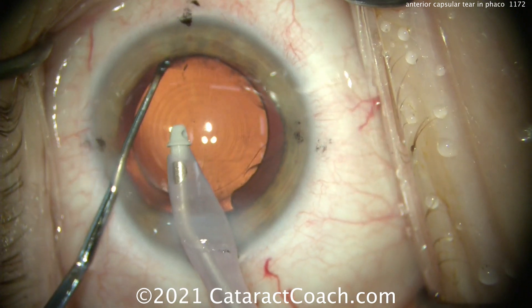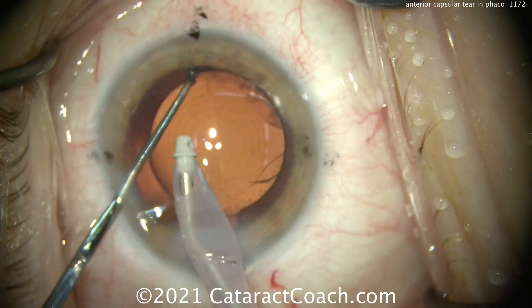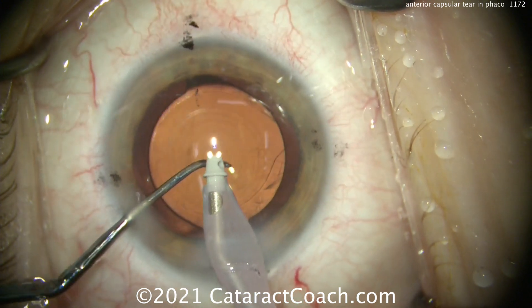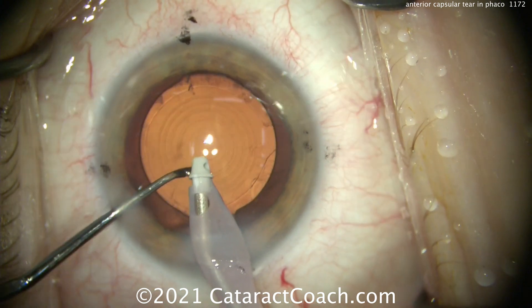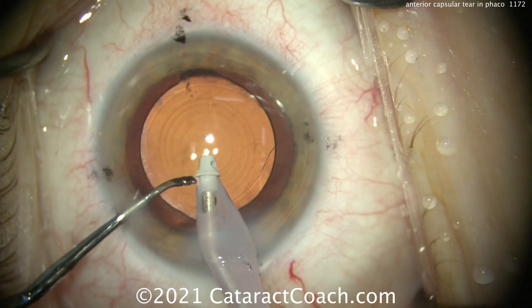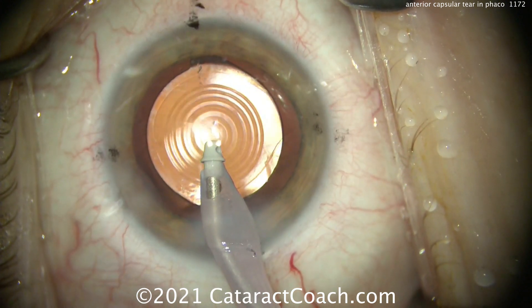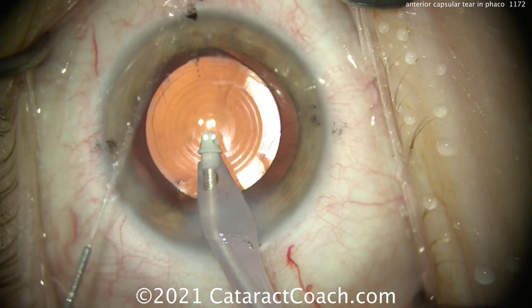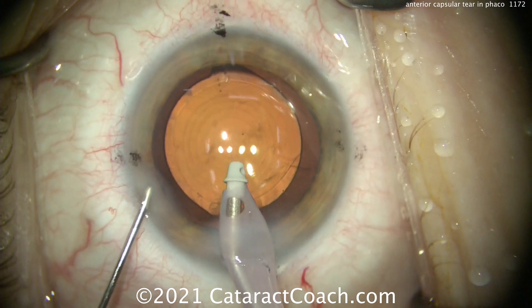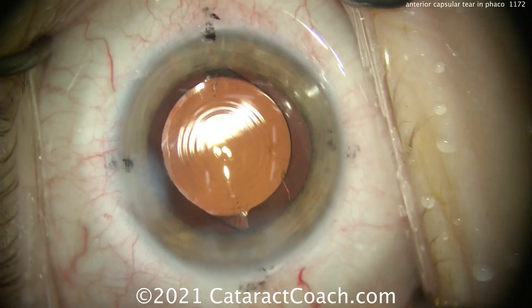Now I'll do a little bit of final rotation, just barely getting it where I want it, getting those lines marked up. You see the alignment there of the toric marks on the cornea and the toric marks on the IOL — we're lining those up pretty beautifully. And we'll get that central optic of the trifocal also centered in the Purkinje image. That looks great. I can tell you the patient had a near-perfect plano outcome and did very well. Certainly her position was good.